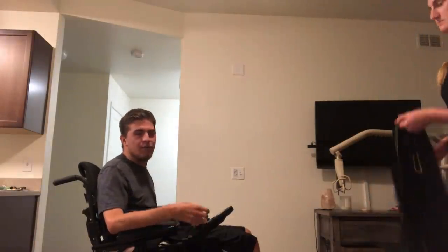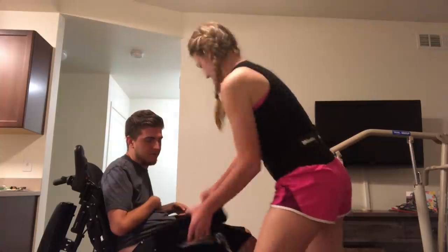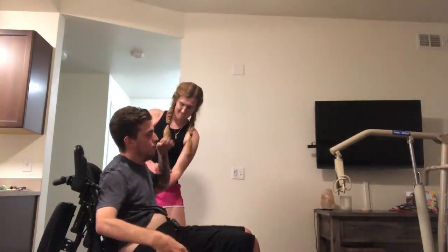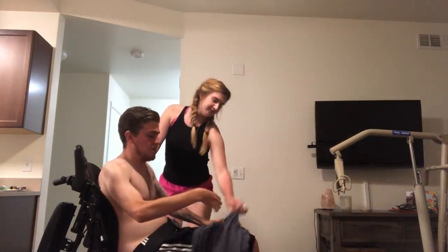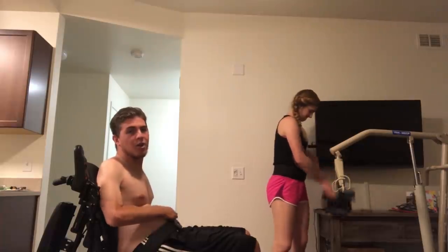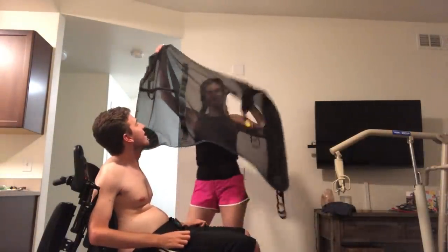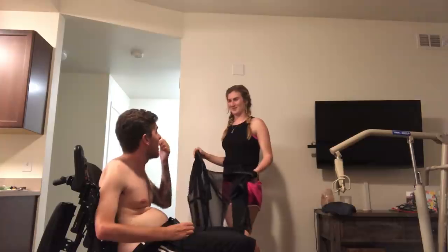First step is we have to fold back my armrests and pull out my side guards so we can get this sling down my back and underneath me completely. At the end of the night my body is always very tight and spastic. This is what the sling looks like — it will go down my back and underneath my butt, and then Bri comes in front of me and pulls it basically down. Everyone has a different way of doing this; this is just our way, the way we found that works best. If anyone else has other alternatives, please let us know.